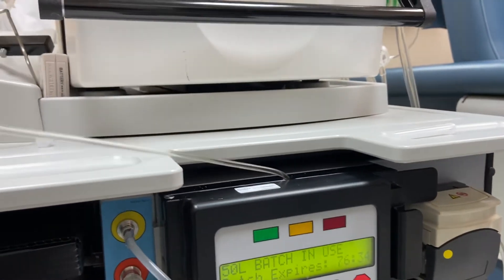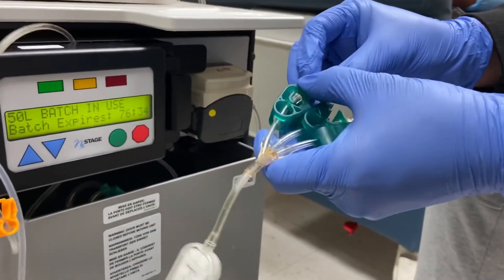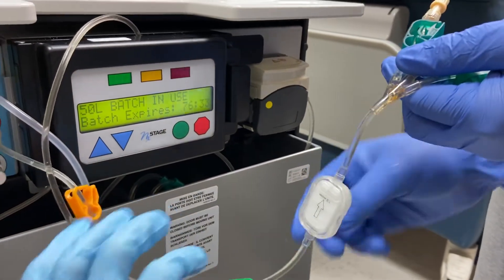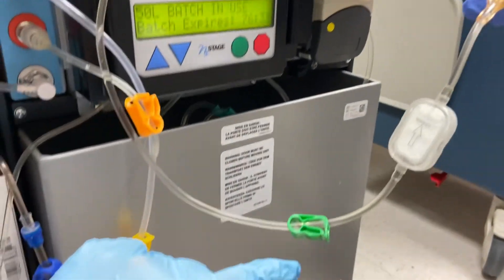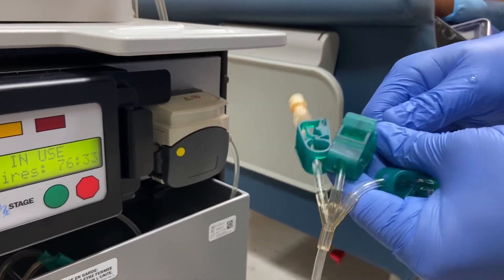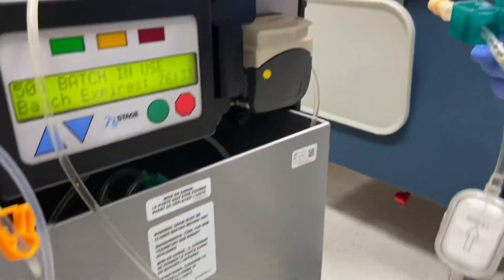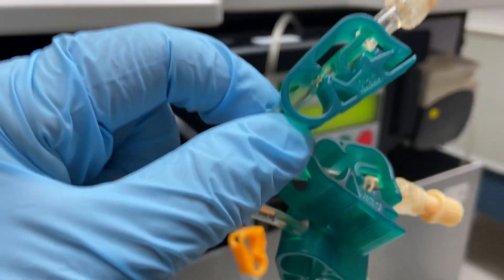We can prime one of the lines. Prime one of the lines. Close. Now we should close here. Let's prime another one — but don't close here, you close down here. Open this first, then you close, you prime. Don't put it so tight. Now close the clamp here. We don't want to close the clamp here because you still can reopen this, but it's harder. Okay, that's it.